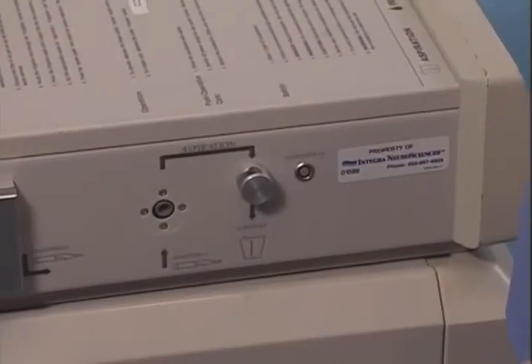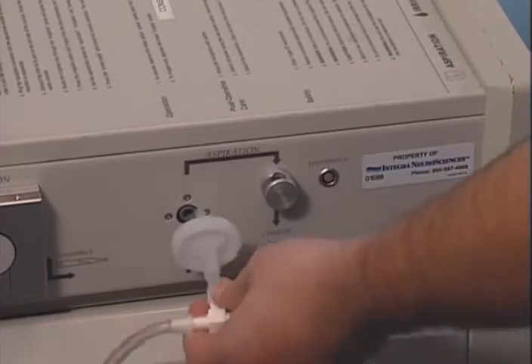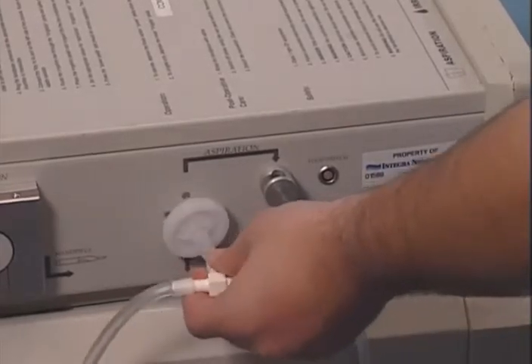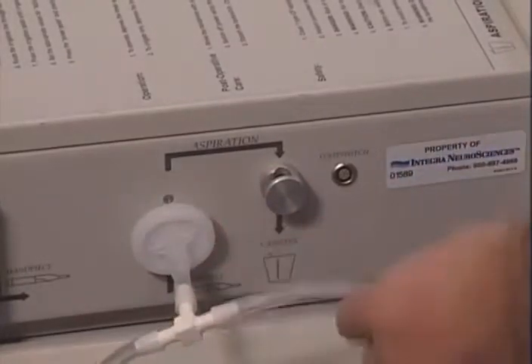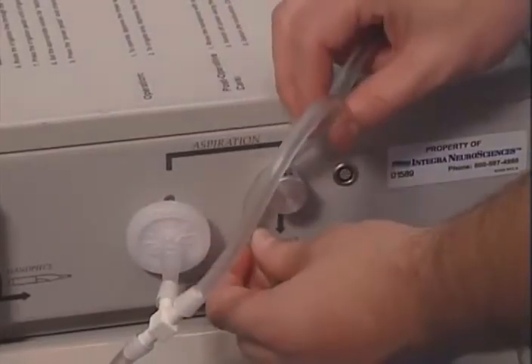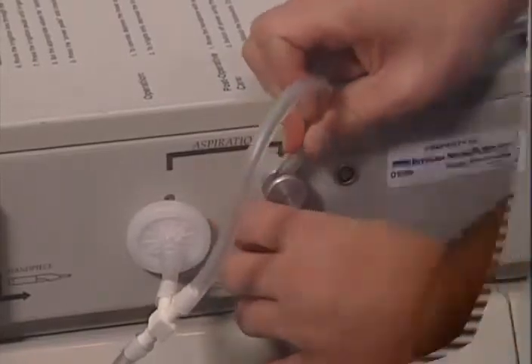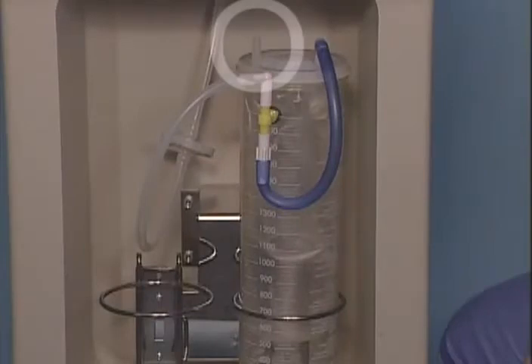Push the filter on the tubing kit into the aspiration filter connection port on the left side panel of the console. Next, follow the diagram on the left side of the console. Route the large bore aspiration tubing through the pinch valve and connect the end of the tubing to the patient port opening on the suction canister.